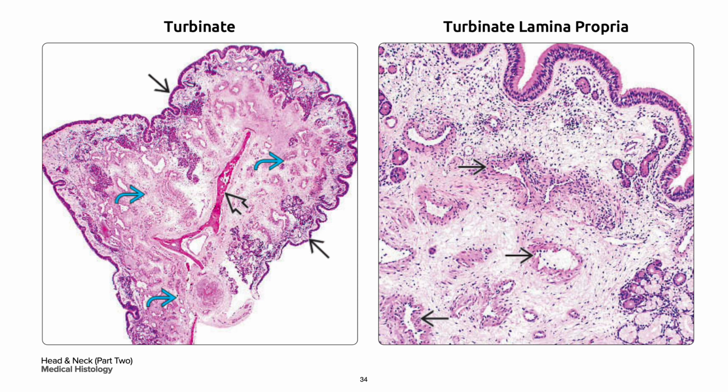On your left is a cross-section of the middle turbinate showing the delicate curved bone core in a bold black arrow, surrounded by your thick lamina propria in a curved blue arrow, which is rich in variably sized vessels and covered by your Schneiderian mucosa in a single black arrow.